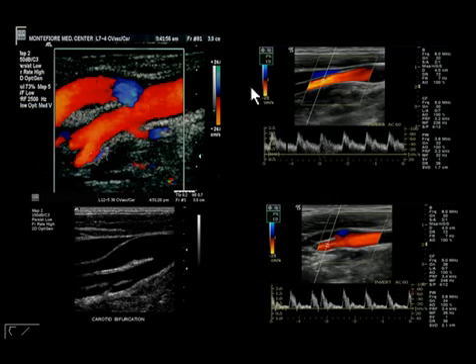But really the primary way to tell the difference is by looking at the waveform, so that when we look at this vessel here, the one located more anteriorly, we see a waveform that yields continuous forward flow throughout diastole, much more diastolic flow than its counterpart, the external carotid artery, which has a sharper peak, much less diastolic flow. And here in this 2D image, without color, we can see the presence of several branches. All of this confirming that, in fact, we are looking at the internal carotid artery in this vessel and the external carotid artery here in the far field.